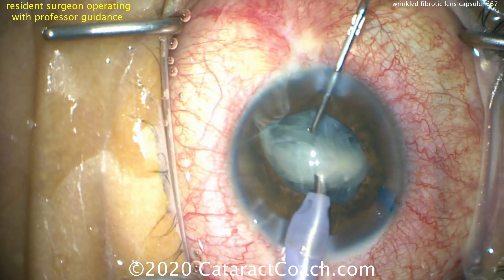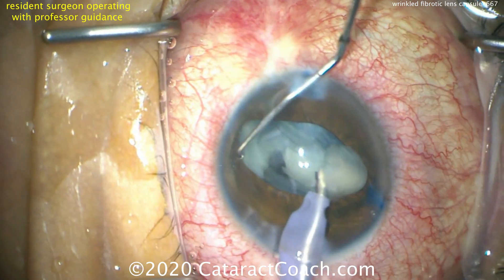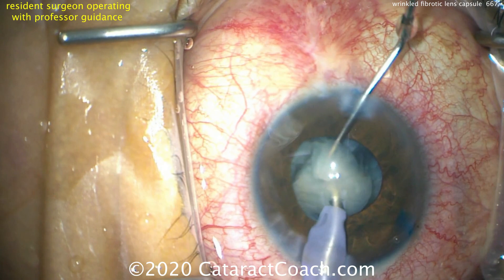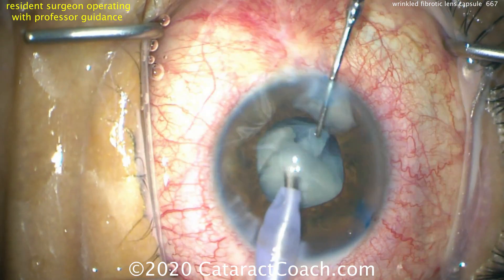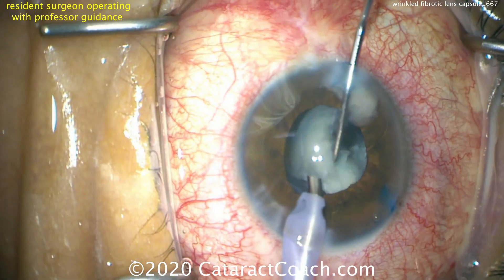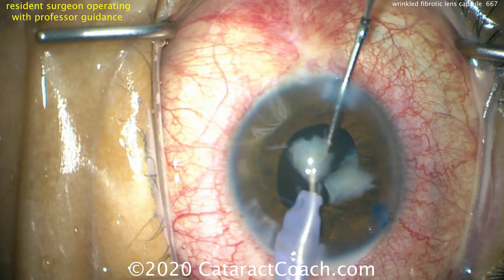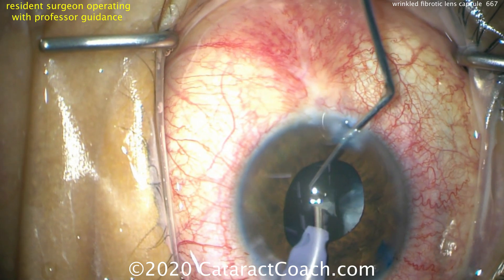With our irregular anterior capsular opening, we probably want to avoid a technique like divide and conquer, because as you try to split the nucleus after making the grooves you may be exerting outward pressure that could cause the capsular bag to rip. Remember there's not an intact round strong capsulorhexis — it's a relatively round anterior capsular opening, but it doesn't have that continuous edge all around and doesn't have that strength. So we're going to be very careful here.